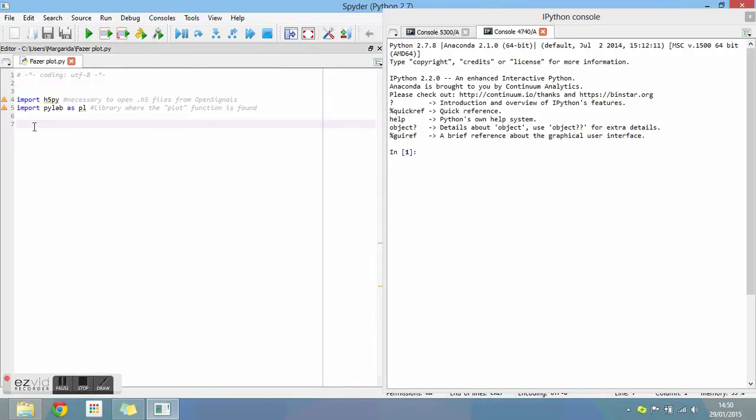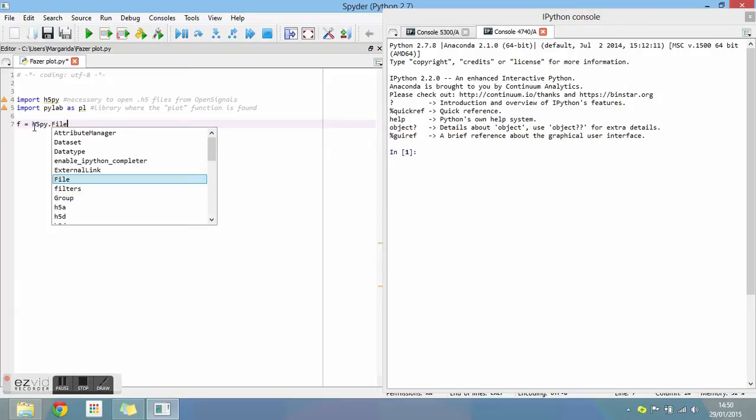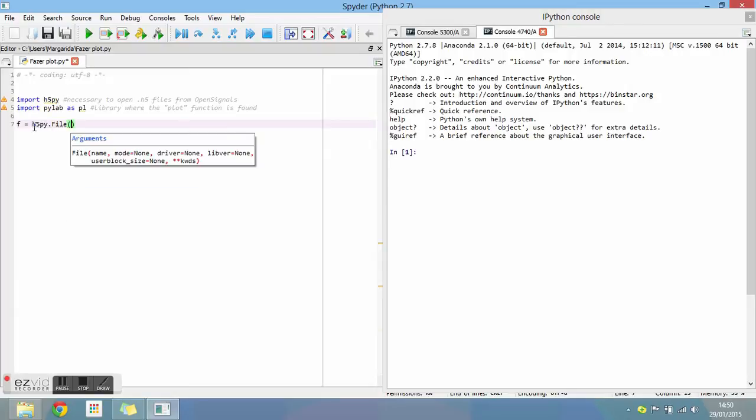To open a file you previously saved on your computer, follow the steps you see on the video. First, write the name of your file exactly as it is saved.